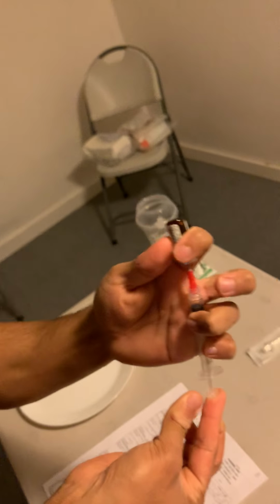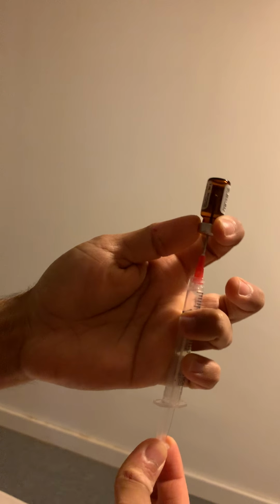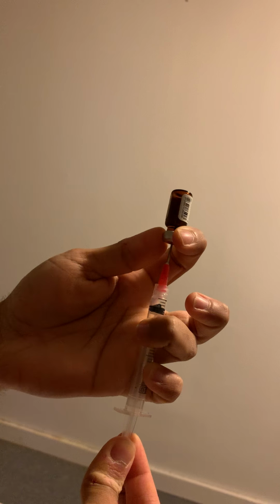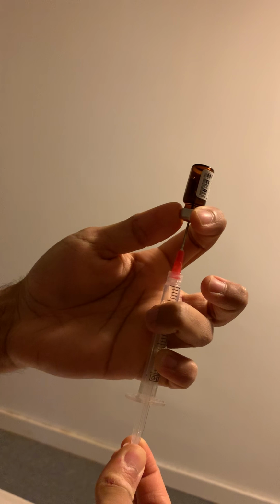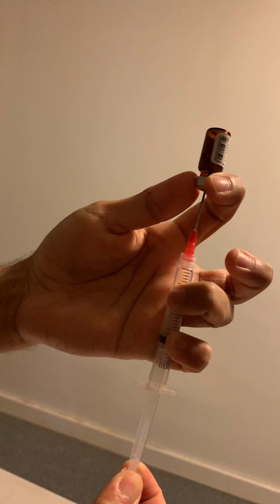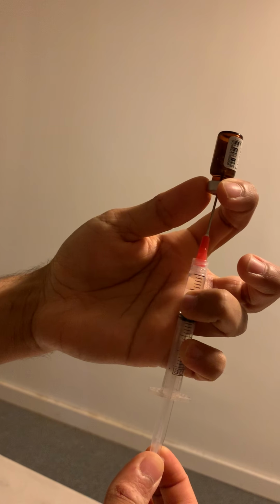I'll be lifting this upside down. I do have more than 1 ml in here.